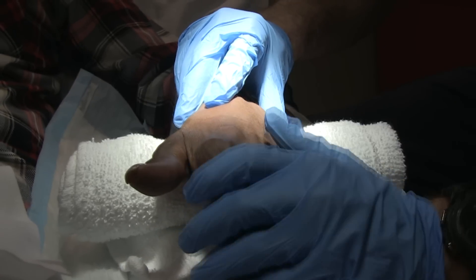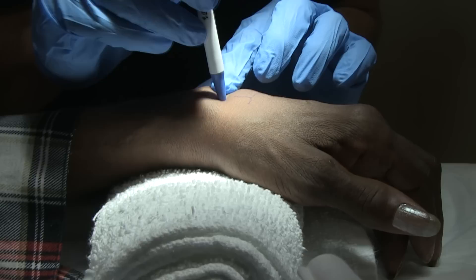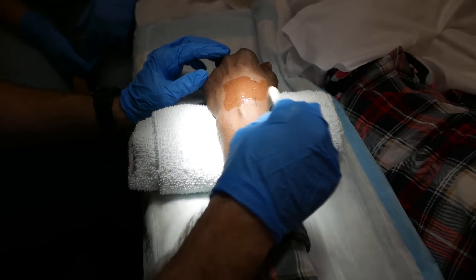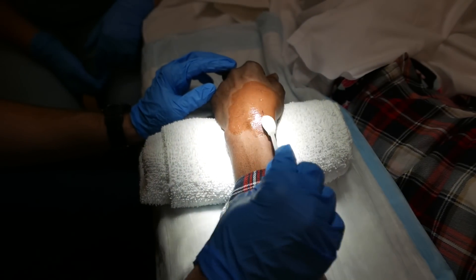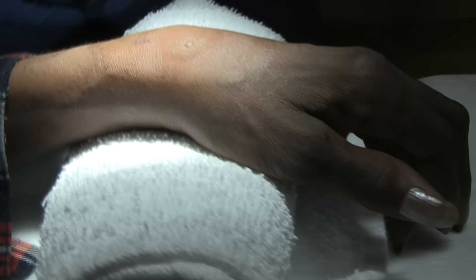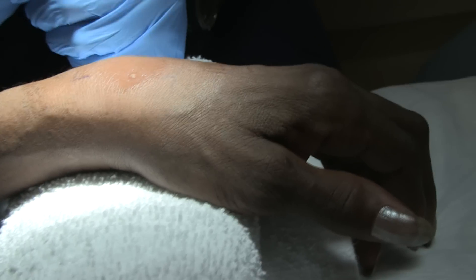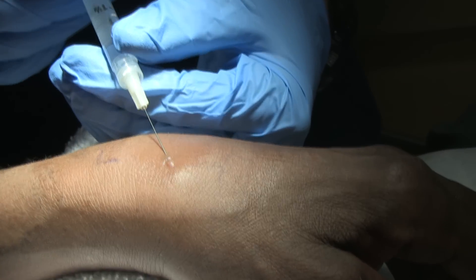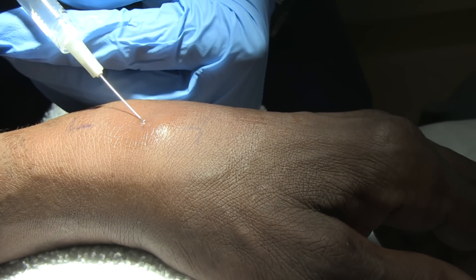We're just going to leave an indentation here. I'm sorry, ma'am, it's going to hurt just a little bit — we're just going to anesthetize for now. There we go. It's nice though — when it gets stuck you don't feel it as bad.